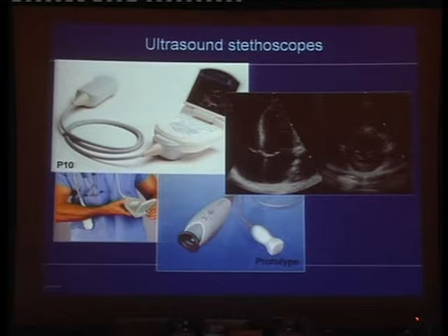This is a real stethoscope because stethos means chest and scopain means seeing in the chest, whereas the stethoscope that we are using and have in our pocket is a stethophone. You can only hear with it. You can never see with it. So that's a misnomer. Now the image quality of these devices is quite good, and just for rapid decision making at the bedside and orientation, it's very useful.